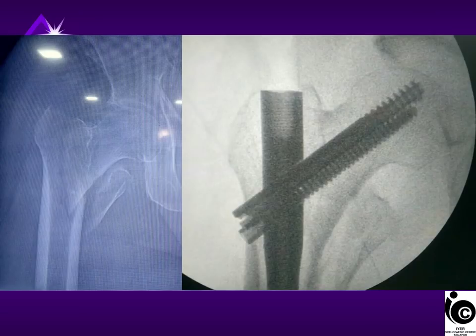The Trigen type of nail has an inferior screw with differential threads compared to the main cervical screw. When you tighten the inferior screw, the cervical screw backs out, compacting the fracture because of this differential threading mechanism. Here too, the screw can be used in 3 settings: 0 mm, 5 mm, 10 mm, or some versions even have a 15 mm compression setting. That you have to decide on table before you insert the screw.